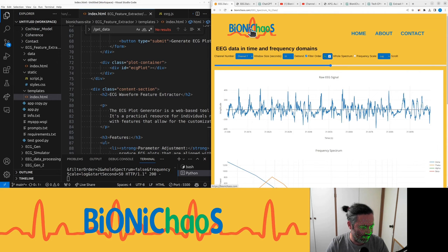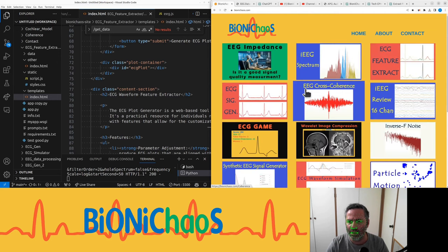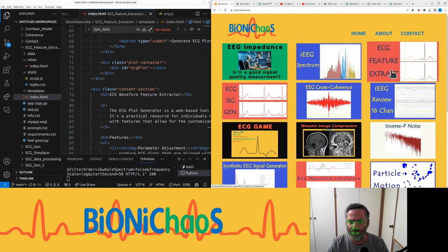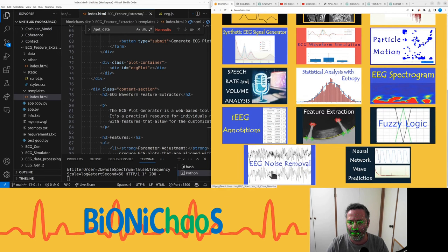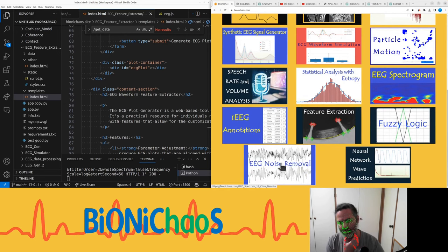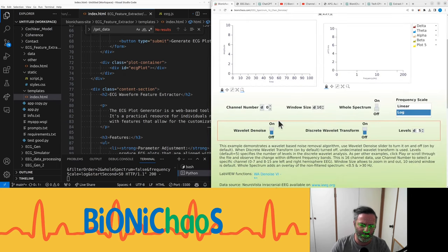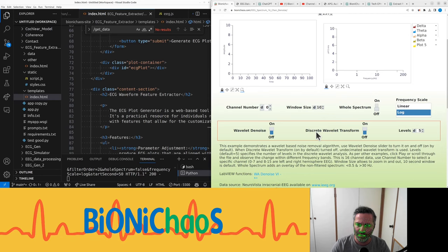And the next in line would be the noise removal. So it would be pretty much the same. For this one we'll have additional wavelet denoising options using a discrete wavelet transform.